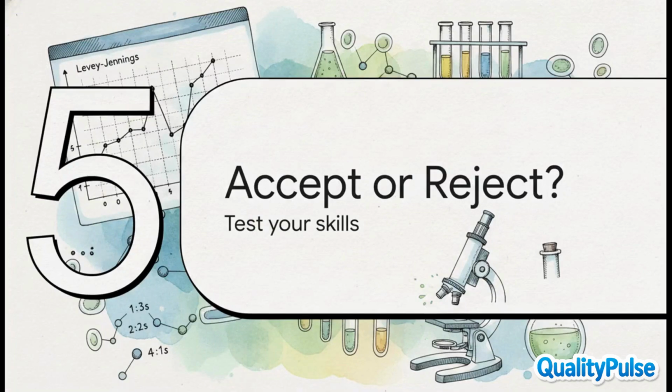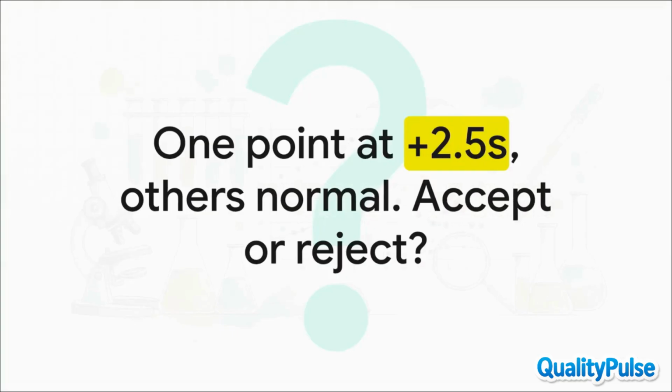Okay, let's actually put this into practice and test those decision-making skills. Moving into Section 5, accept or reject. I'm going to give you a few scenarios, and you have to decide. All right, scenario 1. You run a control, and the result is at plus 2.5 SD. But all your previous runs were tightly clustered near the mean. So accept or reject. Well, think about what rule is being triggered here. Since this is an isolated 1-2S warning, and there's absolutely no systematic relationship to those tightly clustered previous runs, it's acceptable random error. You can go ahead and accept the run, and those patient results can be safely reported.